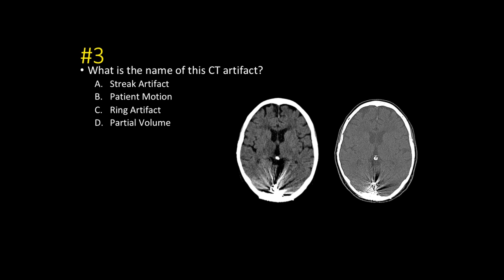What is the name of this CT artifact for case number three? This is streak artifact. This was a patient that had onyx embolization of an AVM, and the onyx material's Hounsfield units are so high on the lookup table that the CAT scan doesn't know what to do with that density and creates a bunch of streak artifacts.